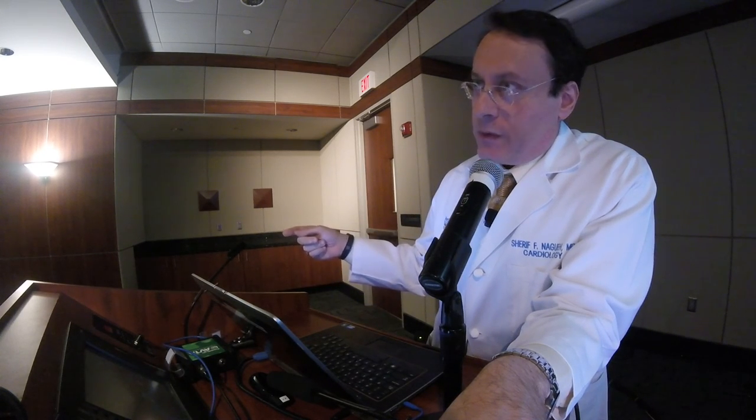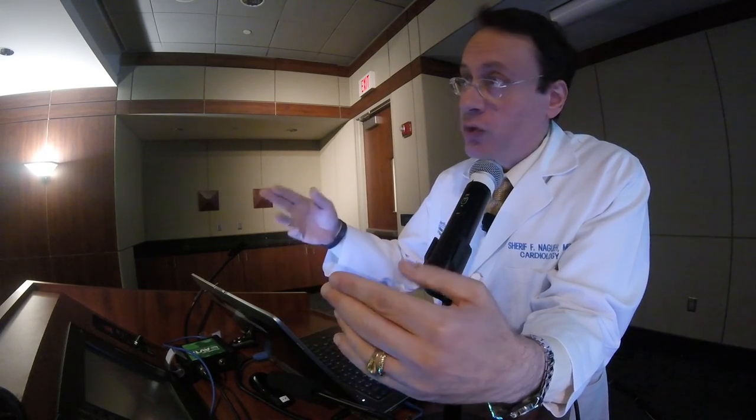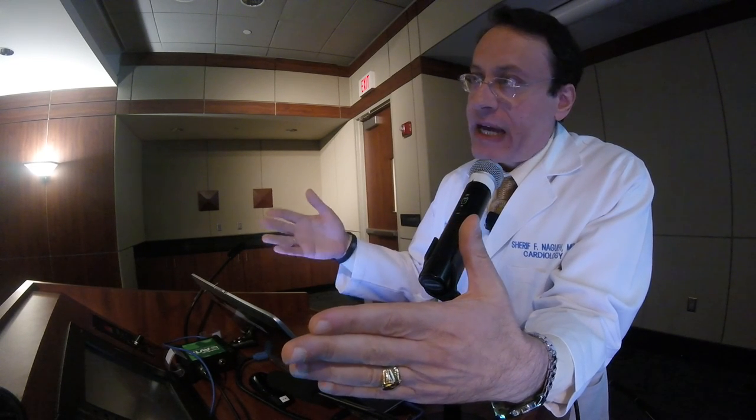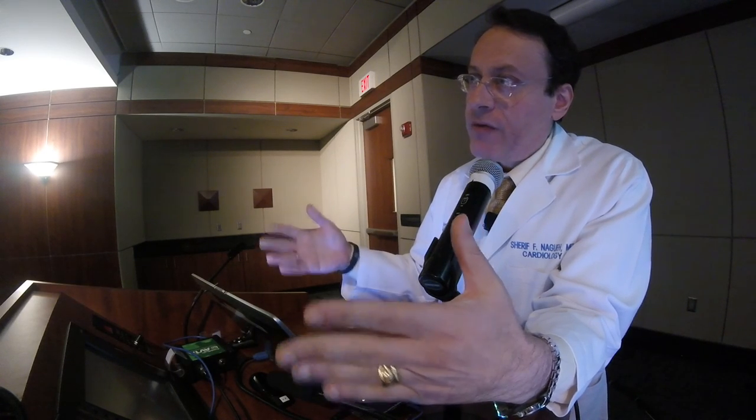So with aging, E prime drops, okay? And E to E prime ratio may increase. If you look at normal individuals that have been published, and we're looking at people, say, up to 70 years of age, not older than that, and I'll tell you why not older than that in a moment, you are looking usually at an average E to E prime ratio less than 15 and at a lateral early diastolic velocity in the 8 centimeters per second range.